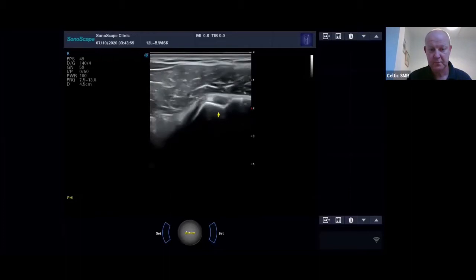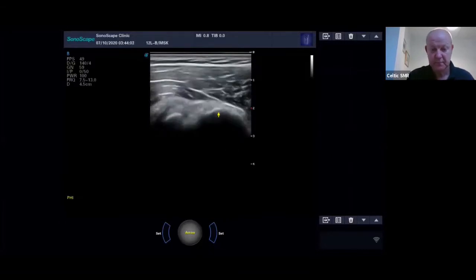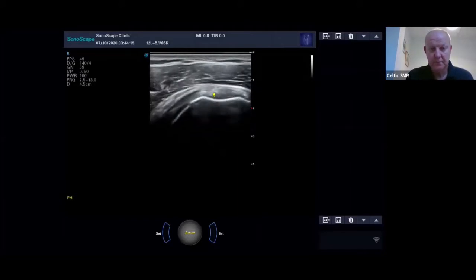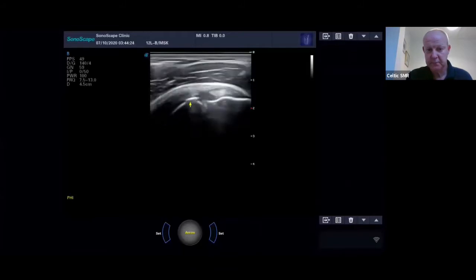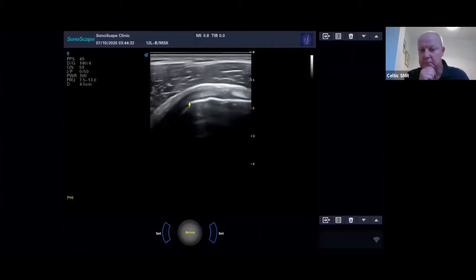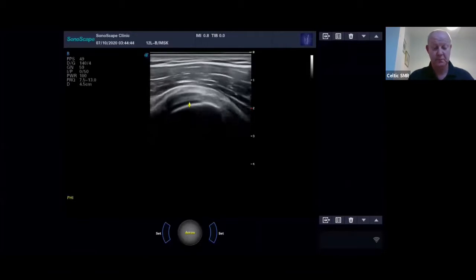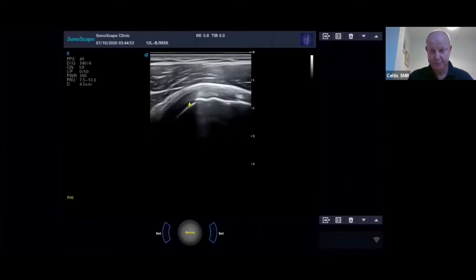Okay. And then I'd look at the subscapularis tendon, which I have to dynamically take out to the side. So you've got a bit of biceps there. Subscapularis here, nice smooth contour. Okay, just remember to scan all the way through the tendon. As I said before, the beam coming out of this frame is 1 millimeter thick, so you're getting a 1 millimeter snapshot here. And that's all you see, so you need to scan all the way through, make sure you're covering it all. Also in transverse, you can look at it. Just remember that you do get a bit of interdigitation with the muscle and tendon there, so it will look a bit strange. But if you do see any pathology, you always check it in two planes.